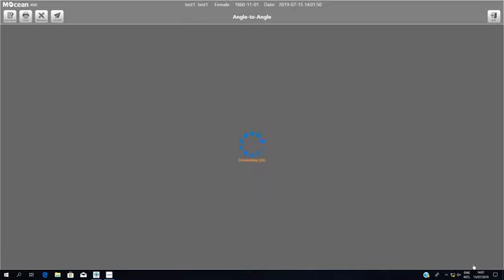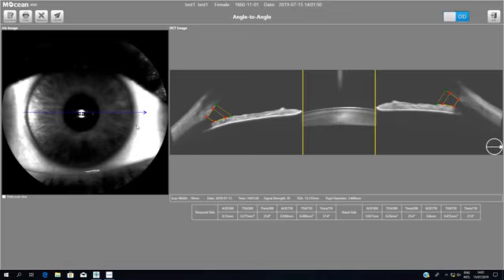If you press the Analyze button, then you're going to have the best quality image, which you see the SLO here from angle to angle, and of course, all the necessary details and informations. You can see that the OCT has automatically drawn some boundaries and some areas.